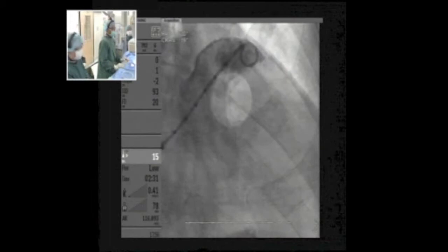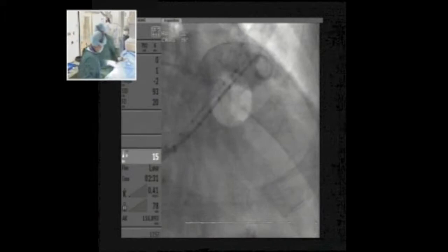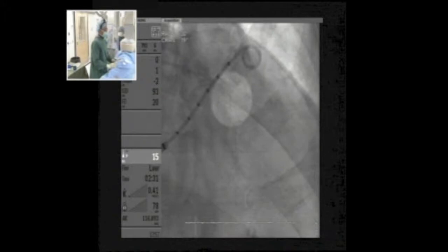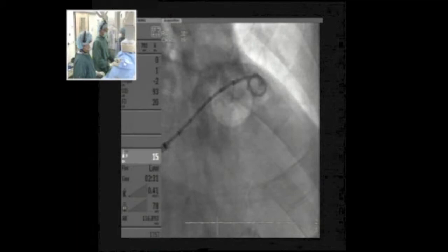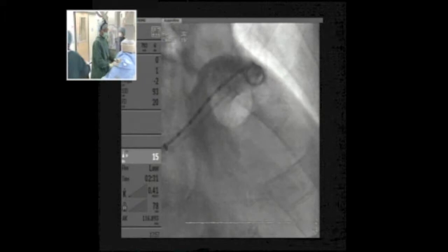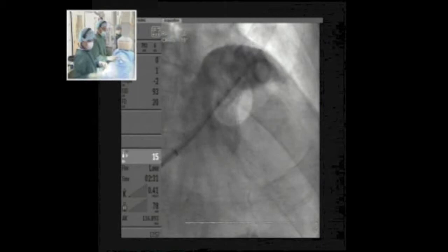We are now in the left atrium. The goal is to place a stiff guide wire in the left upper pulmonary vein to have a good track for the delivery sheath. We will take the multipurpose catheter, put the wire inside, reach the left upper pulmonary vein, and leave the stiff guide wire in place. I'm preparing the delivery sheath in the meantime.